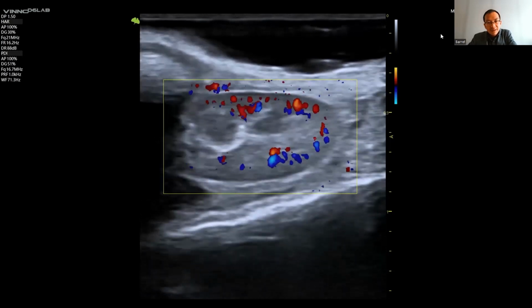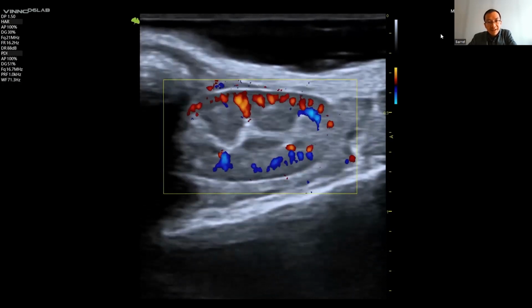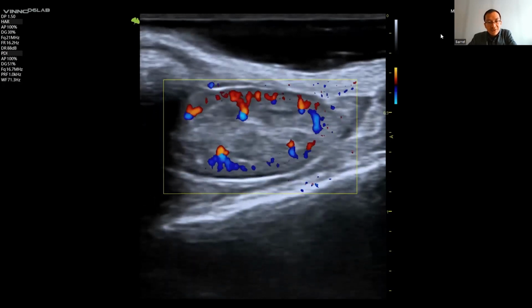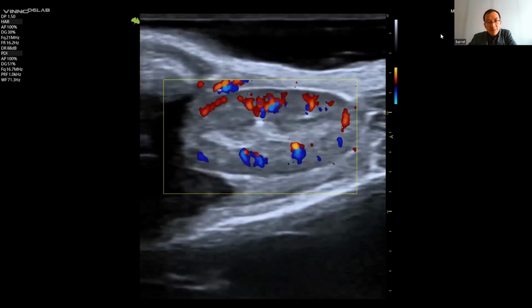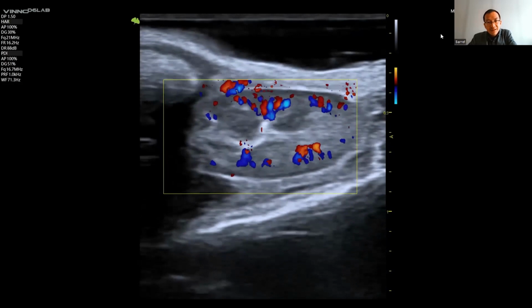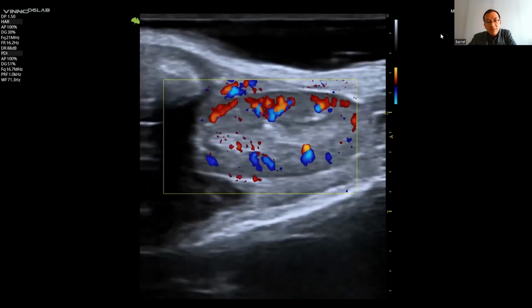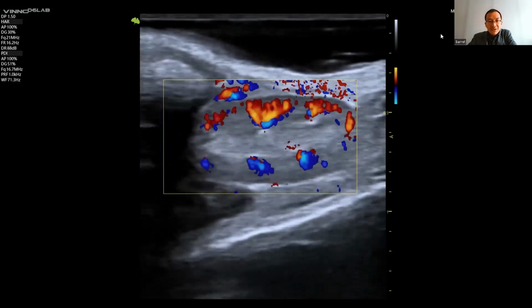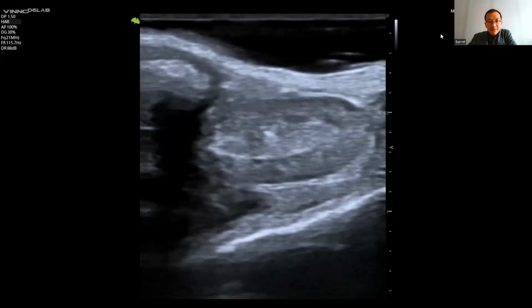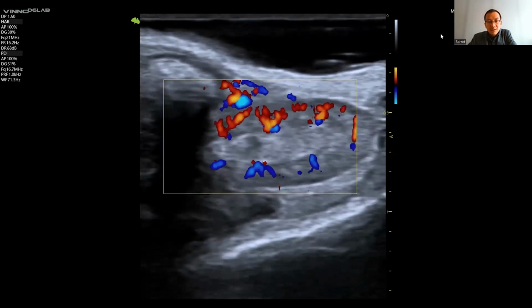Yes. In here, we can see we have very nice color flow sensitivity, and also we can get several micro vessels in here. It means that our laboratory ultrasound has very good color sensitivity and spatial resolution on the microvessels in here. Okay, freeze. Thank you. Okay. Save this image.